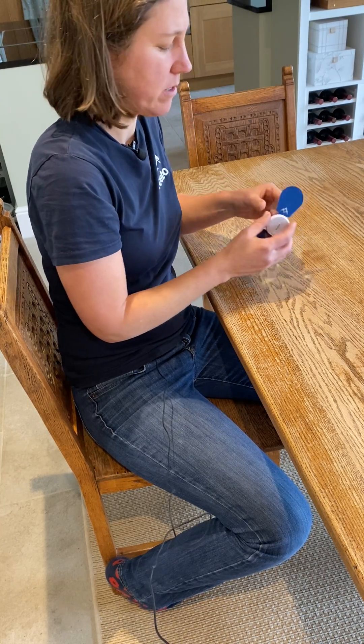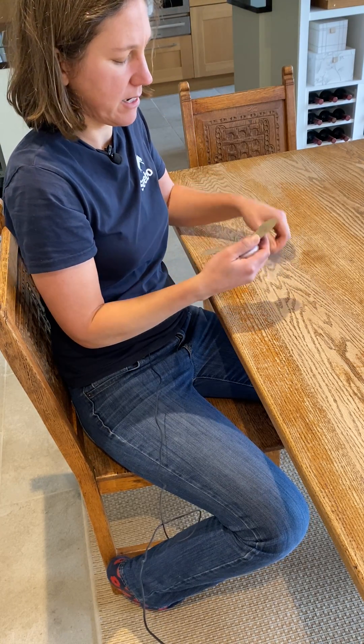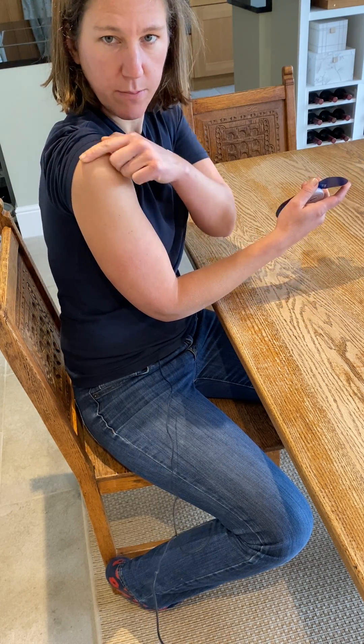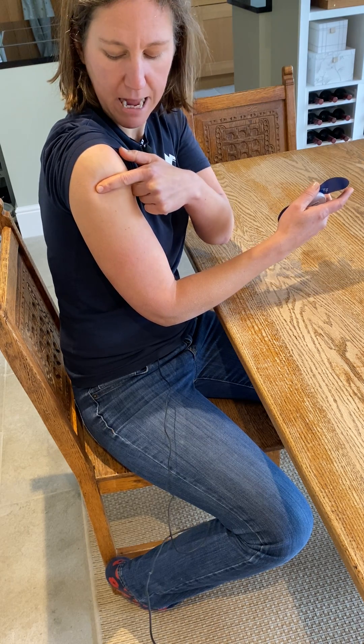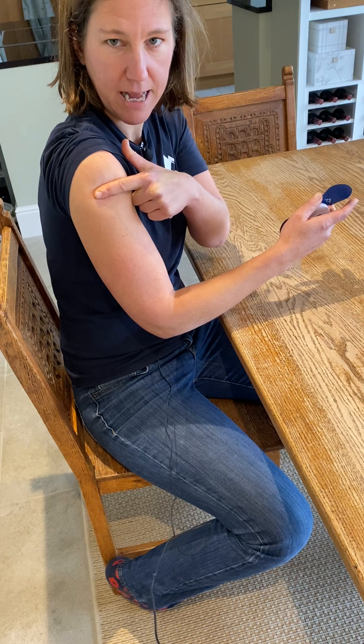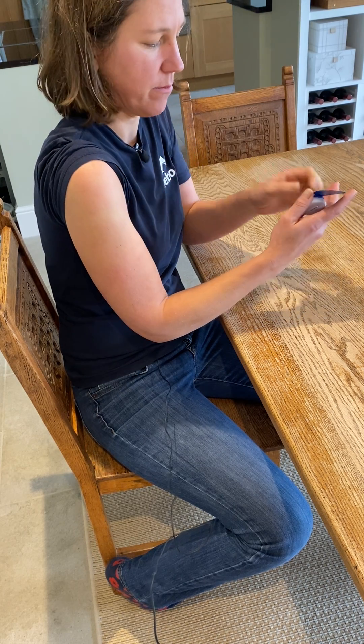We're going to start with the top of the shoulder. The Stim 1 is already set up so I'm just backing off the gel electrodes. For shoulder subluxation, this is where you've got a gap between the muscle bulk and the humeral head. I just run my finger down off the humeral head, feel the gap, and then place the Sabo Stim 1 just as I start to feel the muscle bulk.